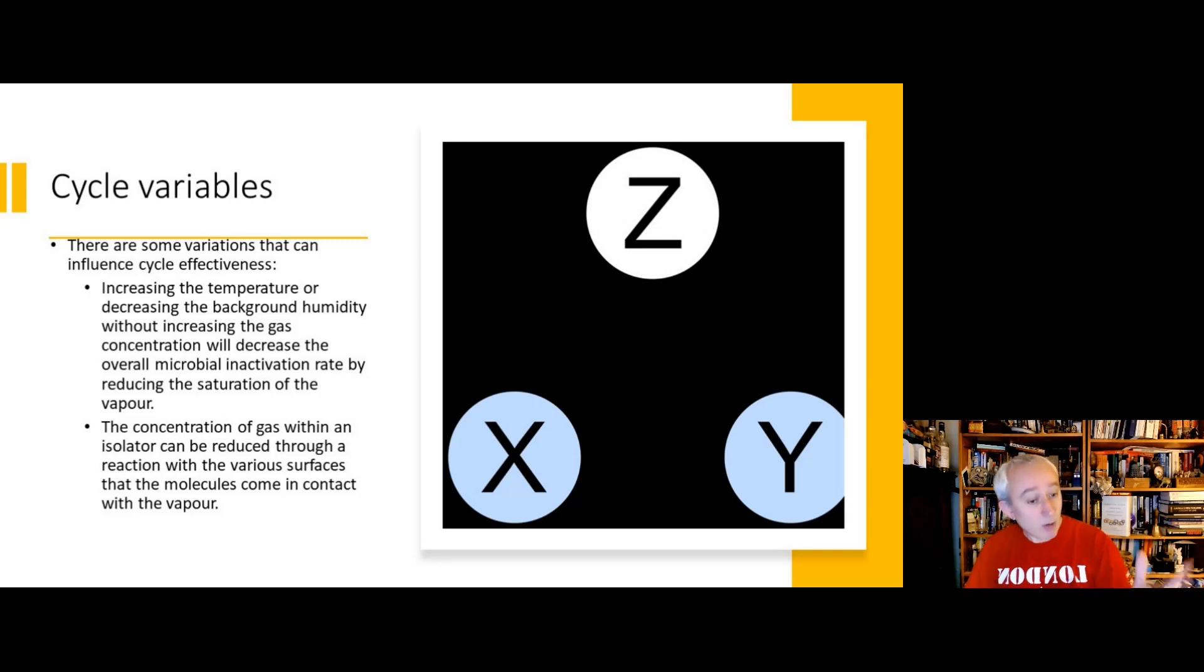Now cycles can go wrong. There are a number of variables. So if we don't get the temperature right, we don't get the humidity right, or we might need to adjust those in order to get a cycle to pass. And also sometimes the concentration of the gas can fluctuate, and we need to make sure that's consistent.